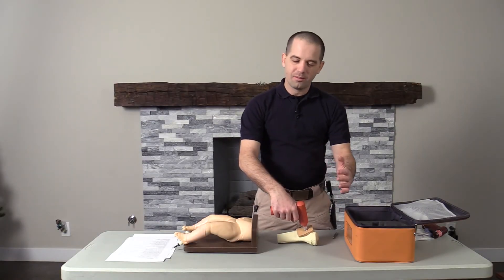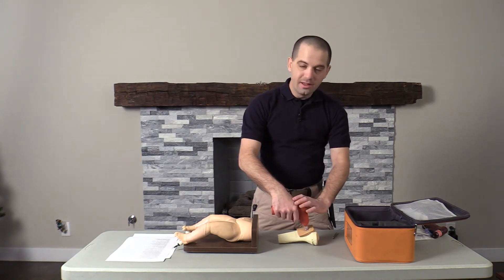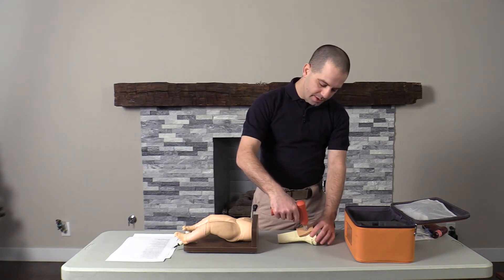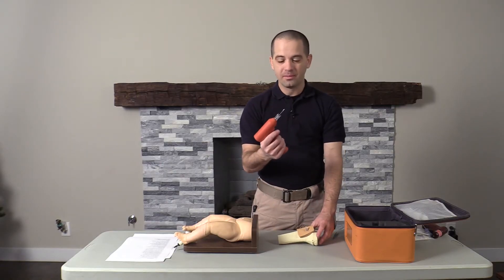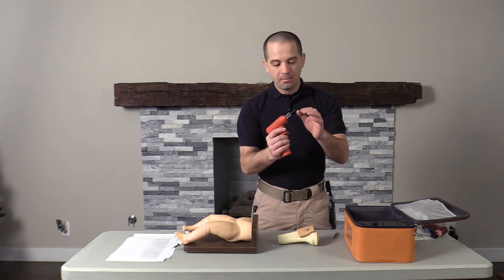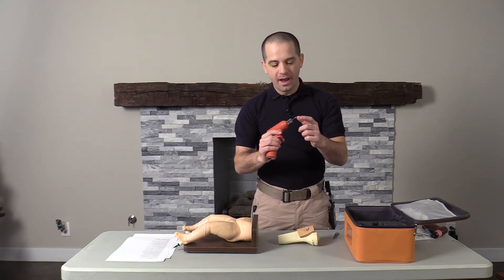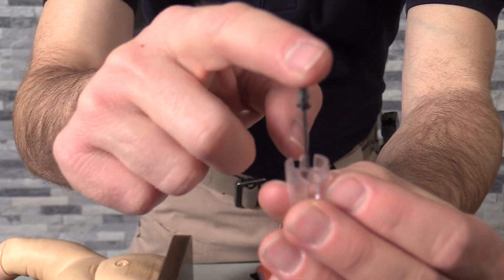One of the things I love about this device is the needle system. Once the needle is placed, all you do is pull up on the driver and the stylet comes out. On top of the stylet is BD's passive safety system that actually deploys a cap over the needle to prevent needle sticks.